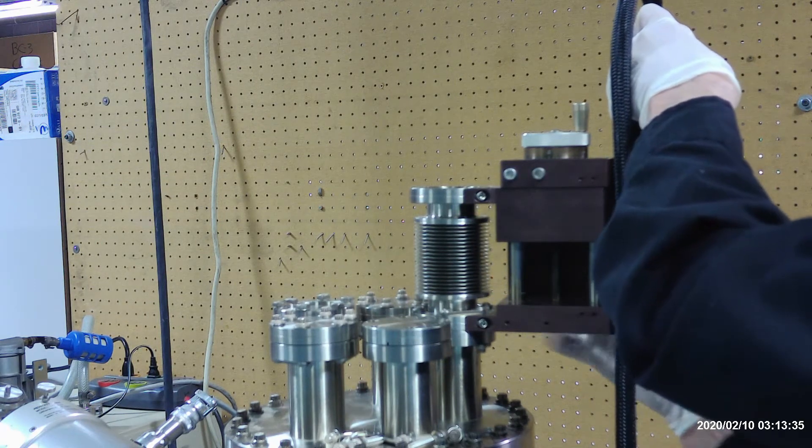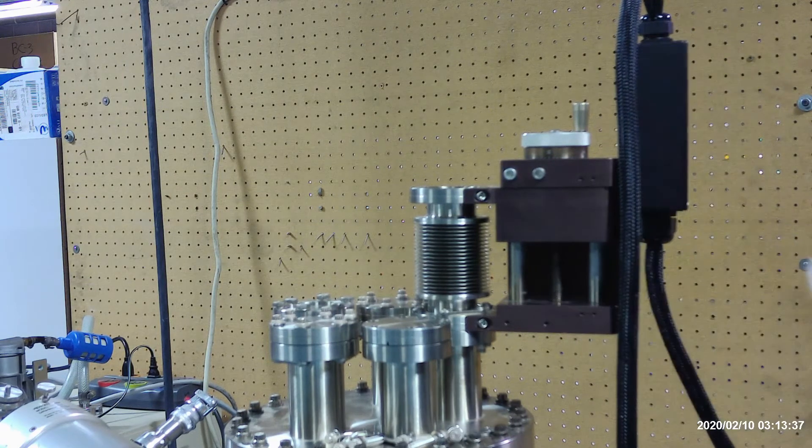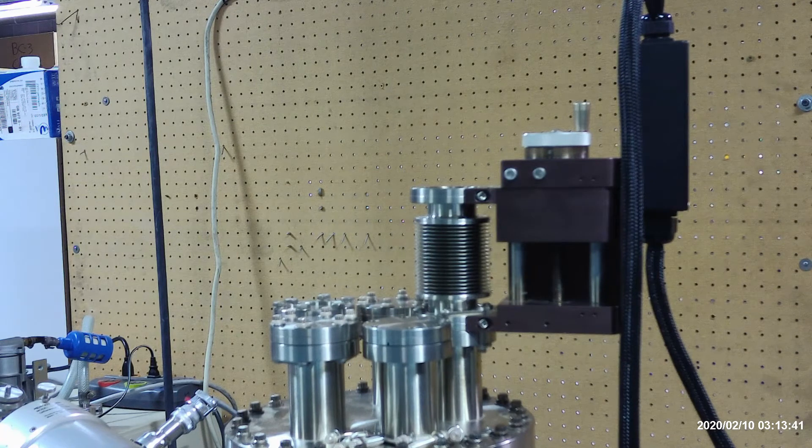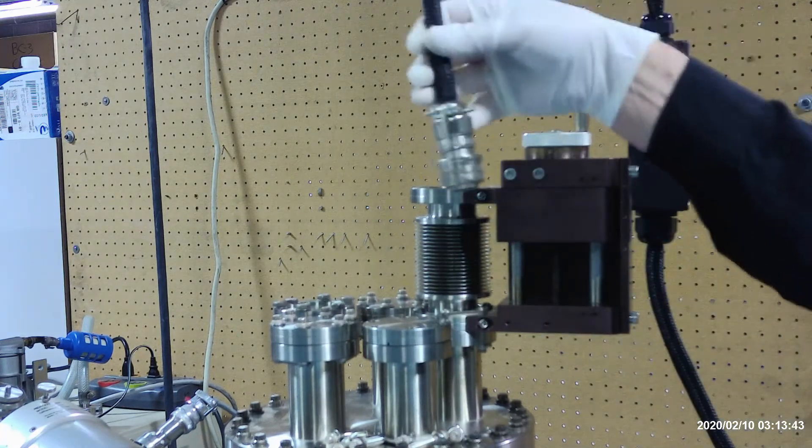I'm tightening the bolt on the back. Now the preamp is attached to the Z-Translator. That's nice because it relieves the strain off this cable.